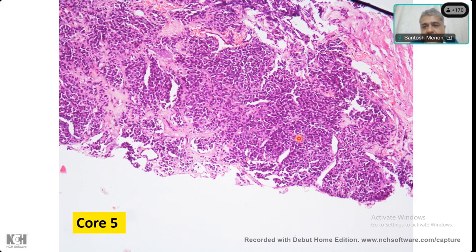Shivani, are you doing IHC? No, sir, I don't know. So Apurva has said PAX8. I think PAX8 doesn't come in urothelial, neither does it come in prostate generally.